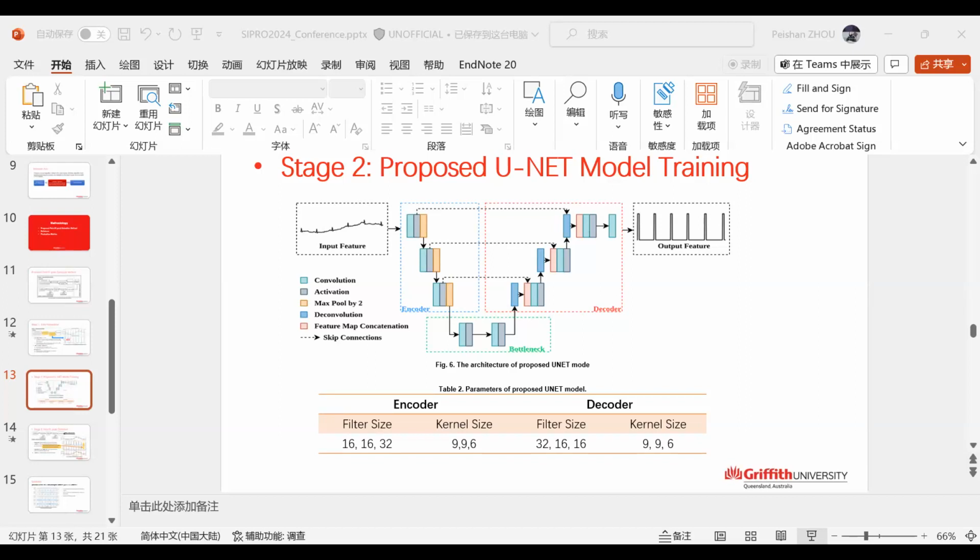If we see the results here, you can see the traditional methods, Pan-Tompkins, do have more false positive and false negative predictions, which, as we mentioned before, is the reason why we want to propose a new algorithm to suit fetal ECG more. Table 4 here shows the average results in terms of three metrics between these three methods, and it's clear that the proposed UNet architecture achieves the optimal performance over the three methods.